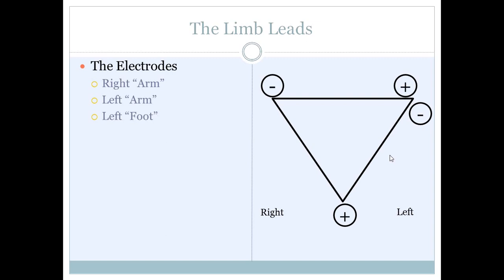and wearing the monitor for a considerable amount of time, having to use the bathroom, things like that, we usually place the electrodes inferior to the clavicle, mid-clavicular line. The left foot lead, usually we put left upper quadrant inferior to the costal cage, or at least not on bone.